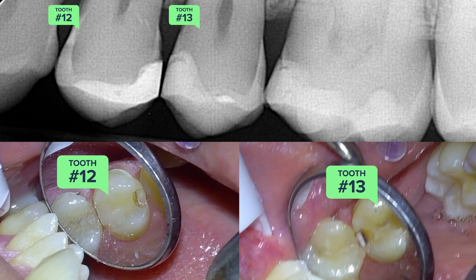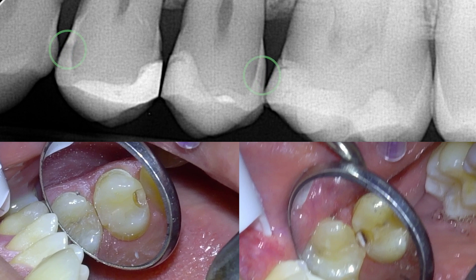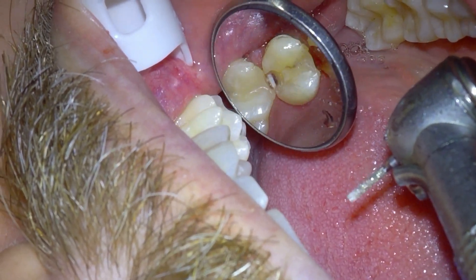X-rays can be misleading about the actual size of cavities. They show you pretty well where the cavities are, but they aren't great at showing size — so sometimes we get in there and it's a complete surprise how big those cavities could be.